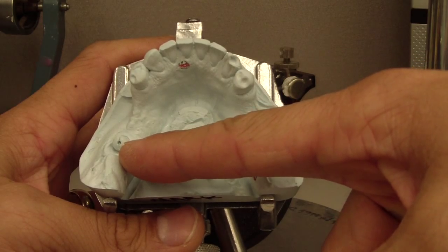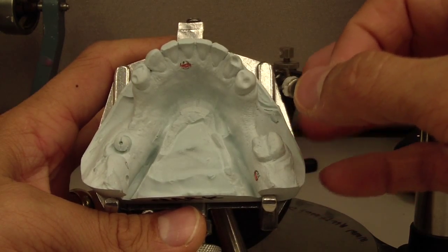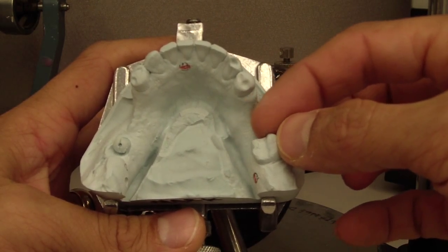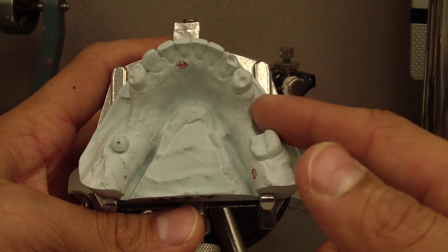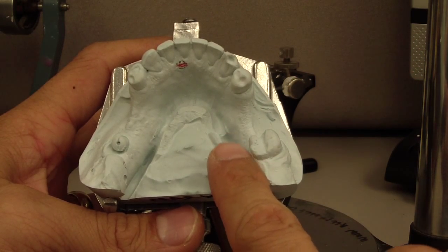We have this healing abutment that's going to serve as a positive vertical stop. And additionally, we have a tooth-supported abutment on the distal portion here. And there's that lingual composite that I added. So we're going to have bracing on the facial portion and engaging the undercut here.